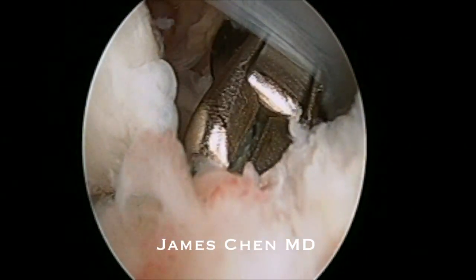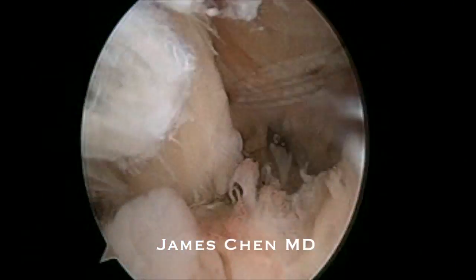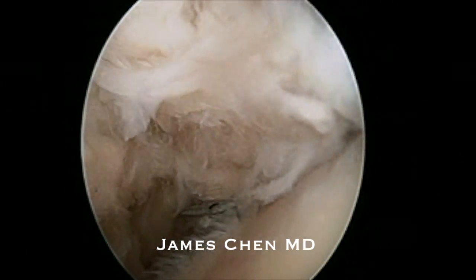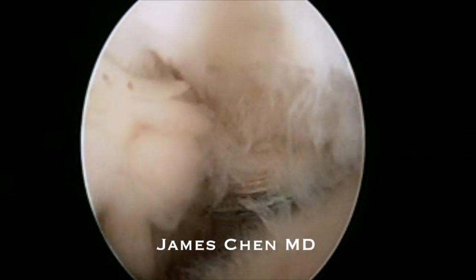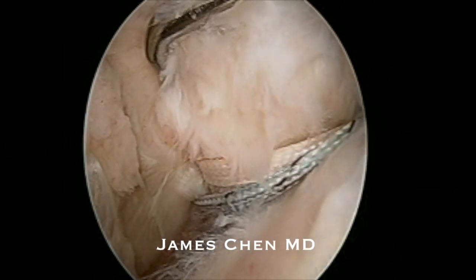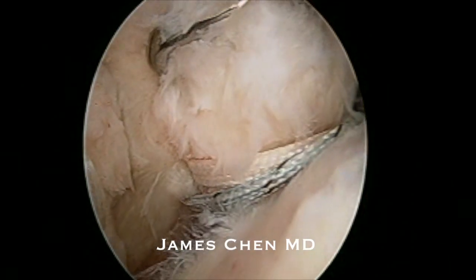I am then cutting the suture and visualizing the repair. Here I am probing the repair and you can see a very tight repair down to the lesser tuberosity.